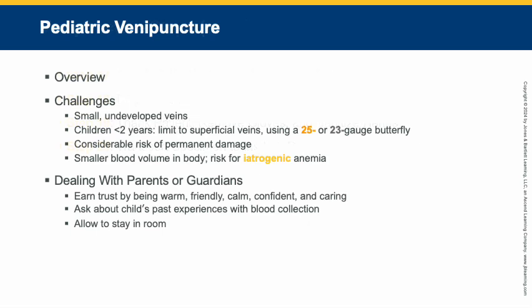Pediatric venipunctures. The challenges are the small, undeveloped veins.